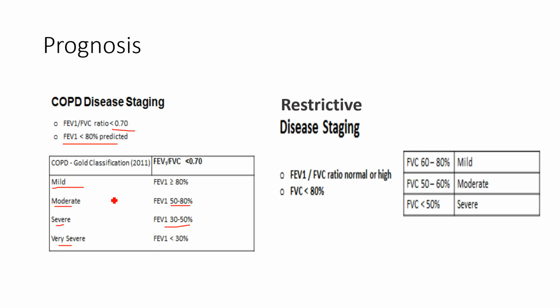Again, remembering COPD is hallmarked by the expiratory flow limitation, problems getting air out. So it would make sense that we stage severity of an obstructive defect by the FEV1, which reflects how well or how poorly they're able to move air out of their lungs.